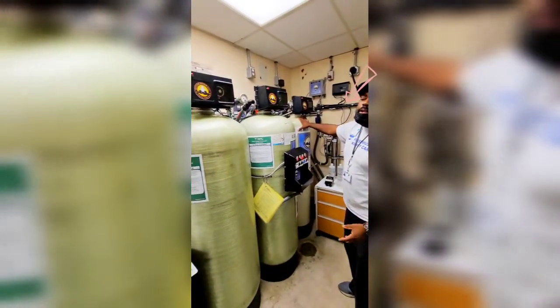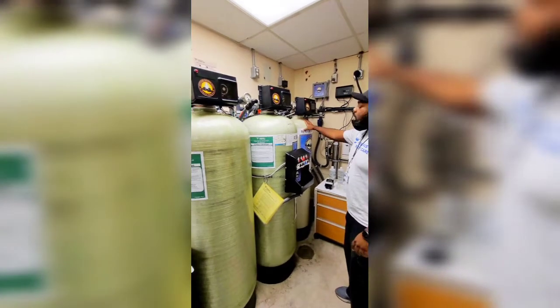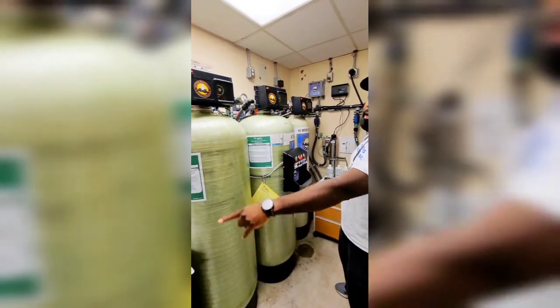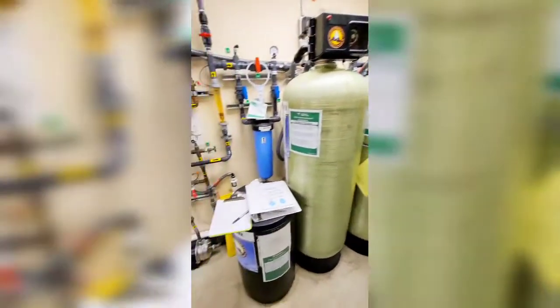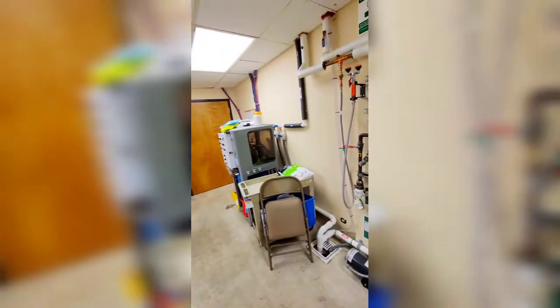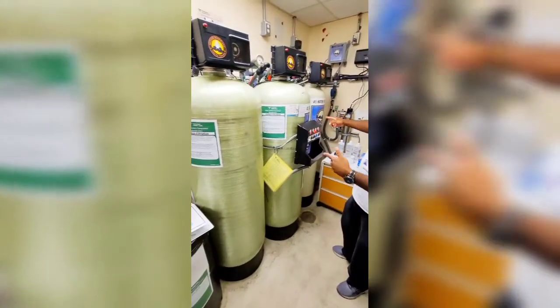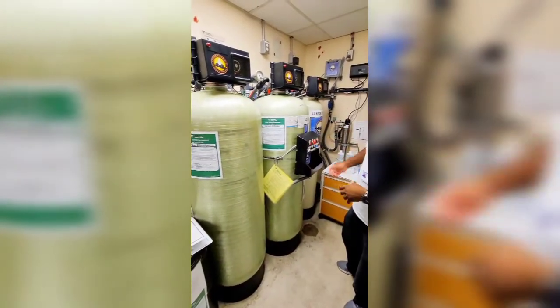The water softener takes out all the hardness out of the water. It's combined with this brine tank, which has salt — we fill the brine tank with those salt pellets as needed. Pretty much what that does overnight is it regenerates the water in there so we can take out more of the hardness the next day.